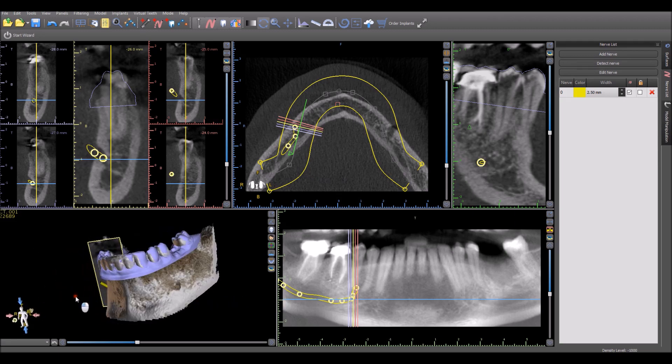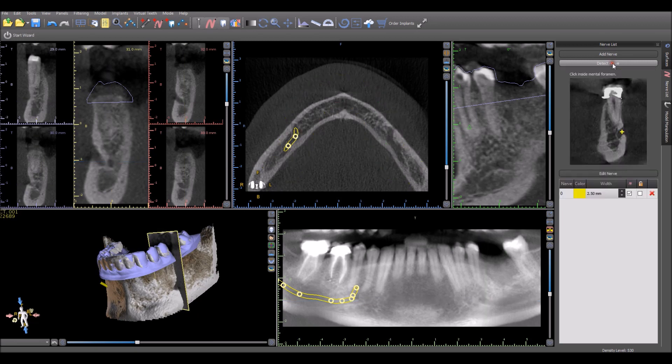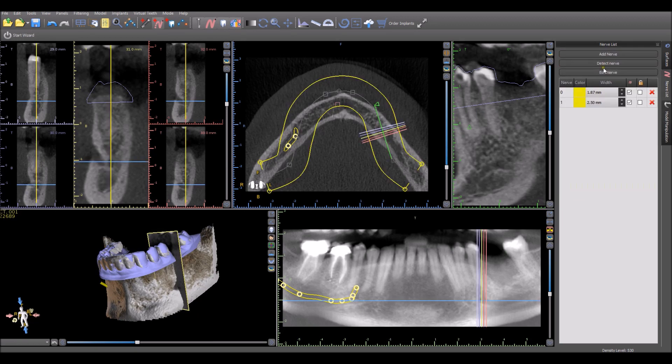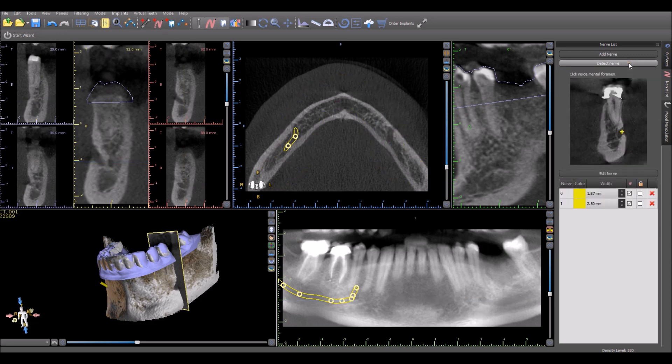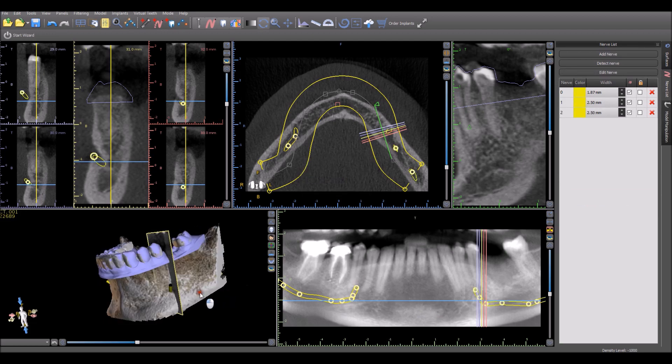We could go ahead and perform the same operation on the other side of the patient. We want to click Detect Nerve again. Once—I'm sorry—we want to click Add Nerve first and then Detect Nerve to make sure it's an individual second nerve and not connected to the first one. And here we have our nerve detection performed once again.